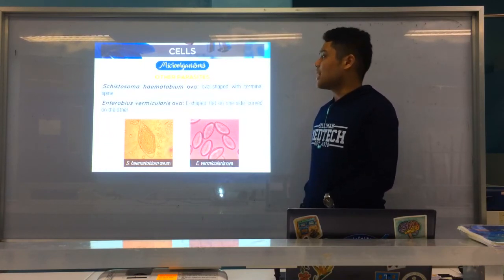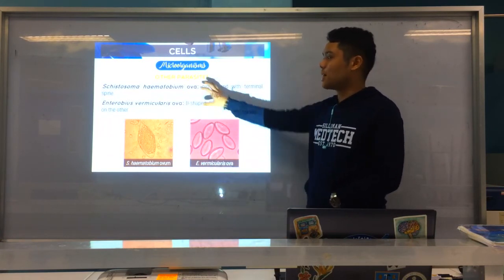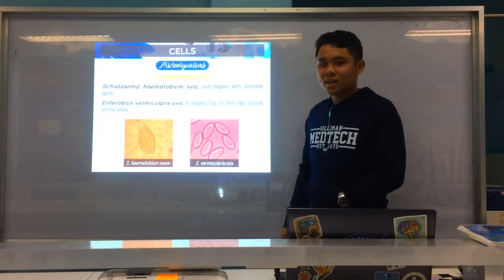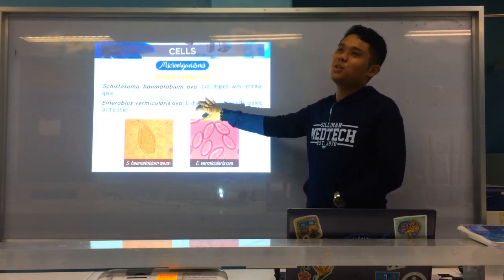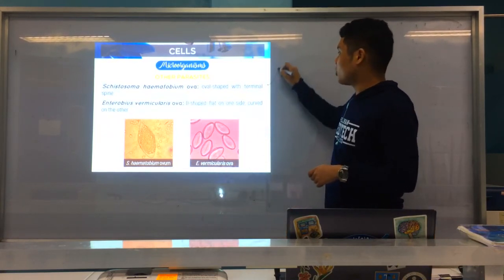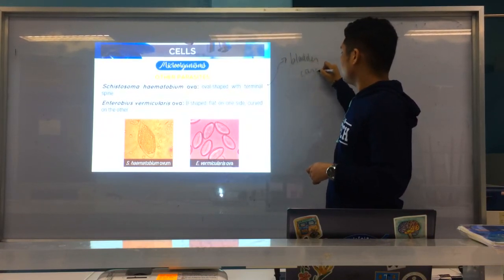So, again, schistosoma hematobium, di ba? Prominent. Alright? I hope na-remember pa ni mga schistosomes, right? Di ba? Mansoni, Japonico, Mekongi, di ba? Schistosoma hematobium, bladder fluke. Usually, if urine or bladder fluke, it's schistosoma hematobium. And schistosoma hematobium can also cause bladder carcinoma.